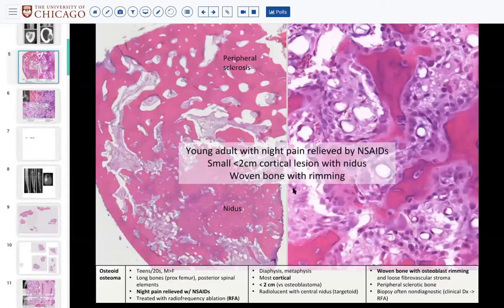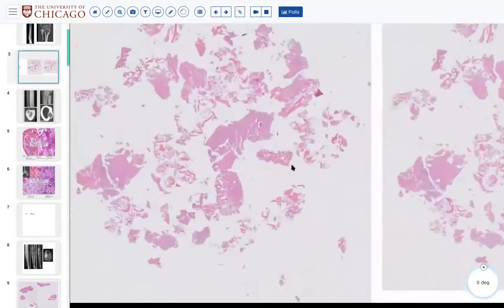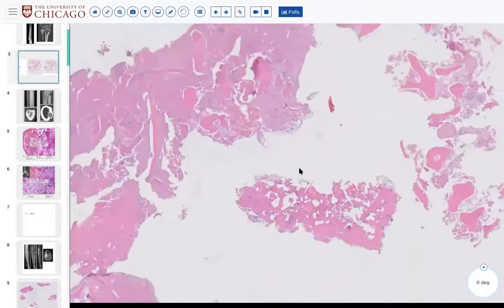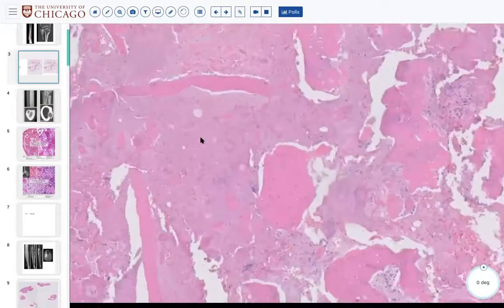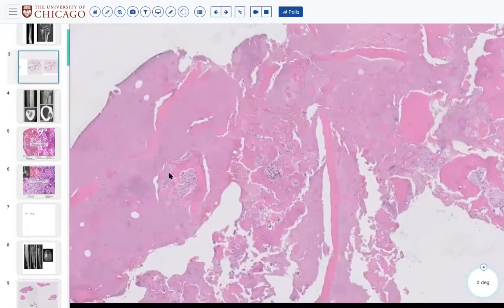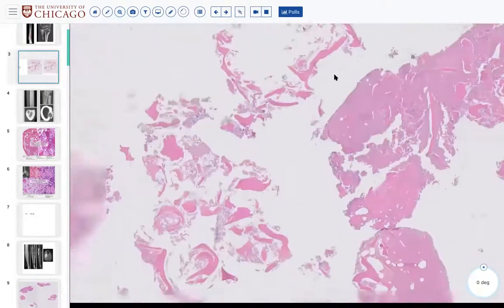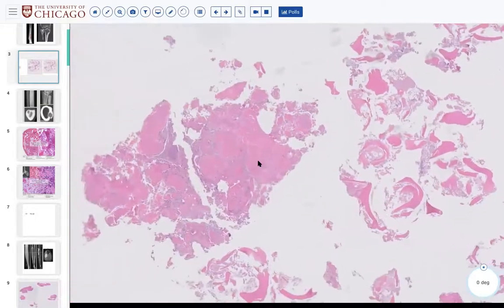So in this presentation, I've put for you my bullet point slide about these. Basically what you might get on biopsy, quote unquote biopsy, is minimal, right? As you saw here, a ton of this is just junky lamellar bone with, I would argue, this stuff in between basically just bone dust and debris, but the actual lesional component is sparse. Why is the lesional component so sparse?